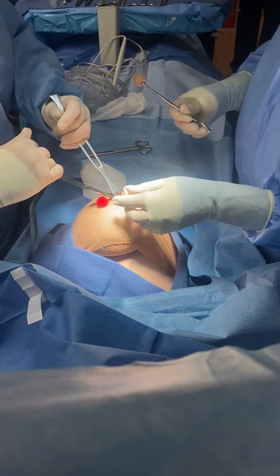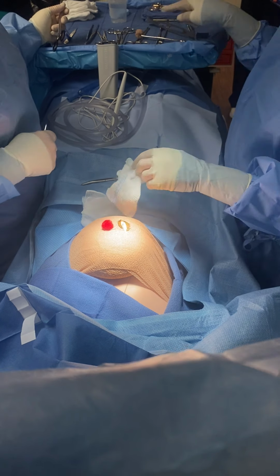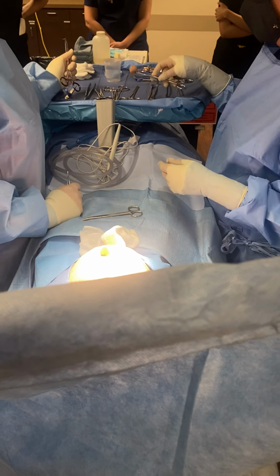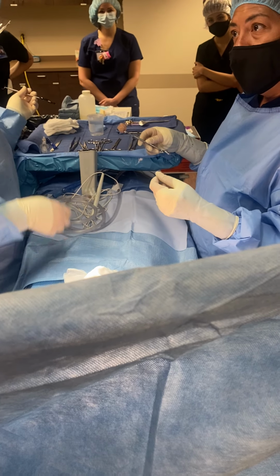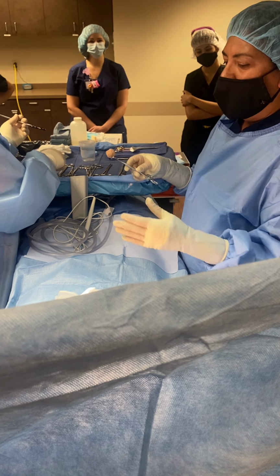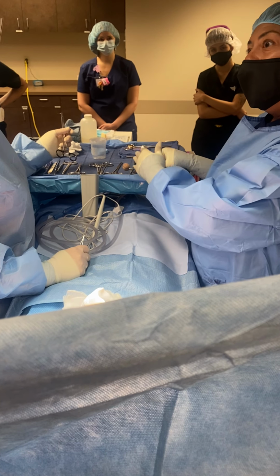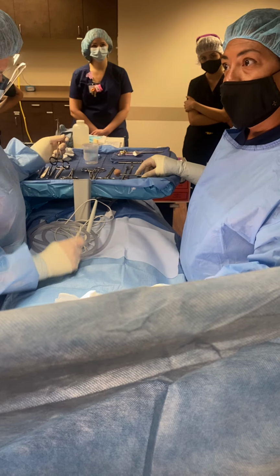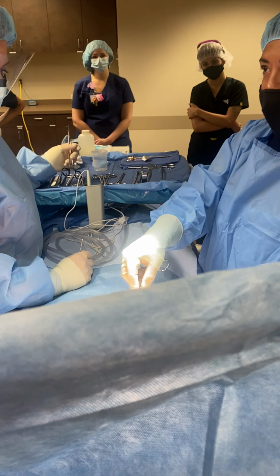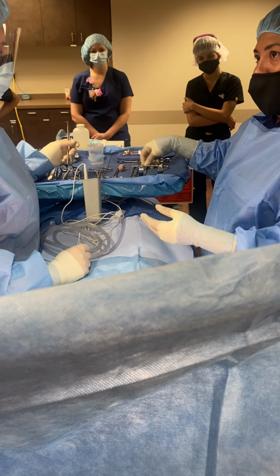Yep. All right. Can I come out? Come on out, please. Yesterday we discussed orientation. When we pull out the mass, of course, we're going to want to mark it so that we can ensure the orientation and what part of the anatomy it actually came out of. When it gets sent off to pathology, if they find any cells, then we can go back in and that would be where we would go looking for more. So when they place it on your field, you want to make sure that you don't move it, because a lot of times they know exactly how they pulled it out and how they placed it. If you grab it and move it, what would have been anterior might now be marked superior.